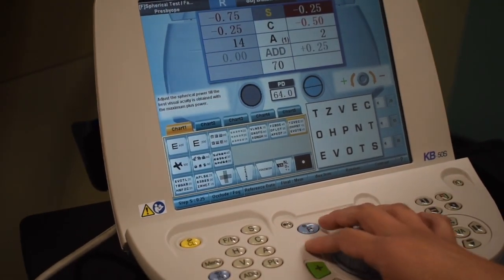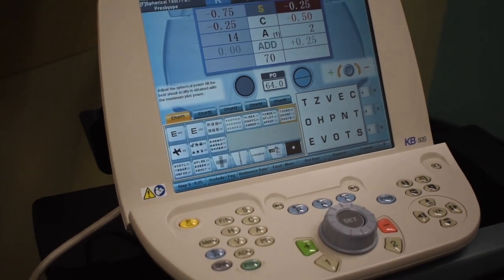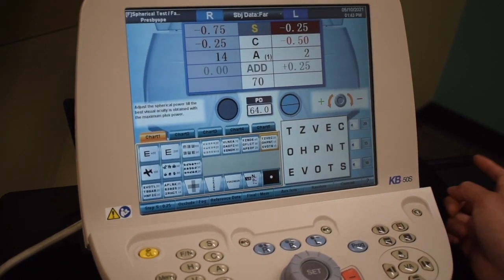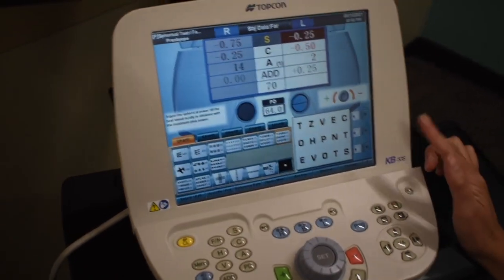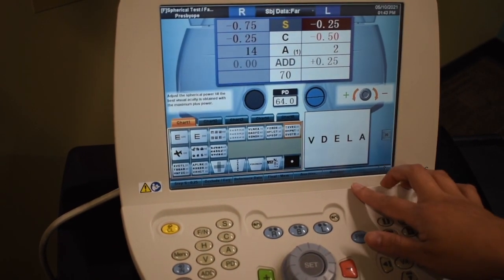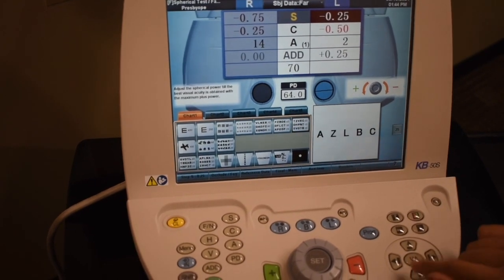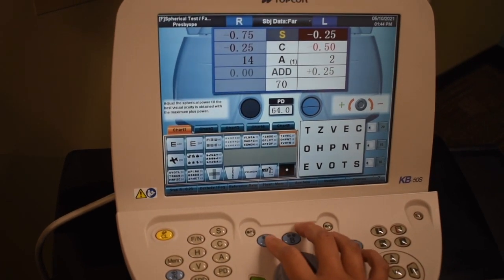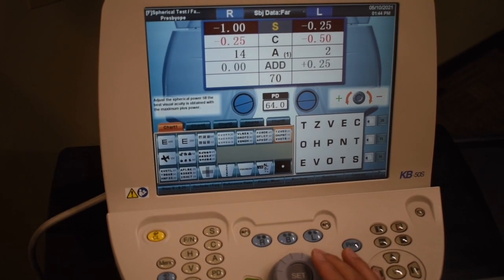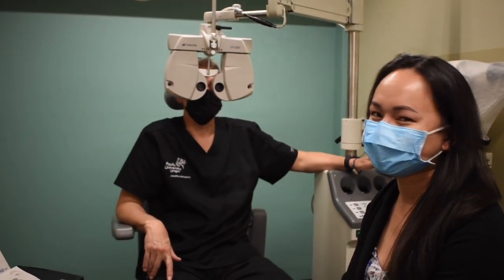Now let's move on to his left eye. Patient reads: O, H, P, N, T, and then E, V, T. So we got 20/15 plus three. A little trick: if you have patients that are really good at memorizing the letters, to randomize the letters you hit random in the top corner. You can click here for 20/15 or go up to 20/25. Now checking both eyes — patient reads E, B, O, T, S — that's 20/10 OU. And that would conclude the distance refraction. Great job.